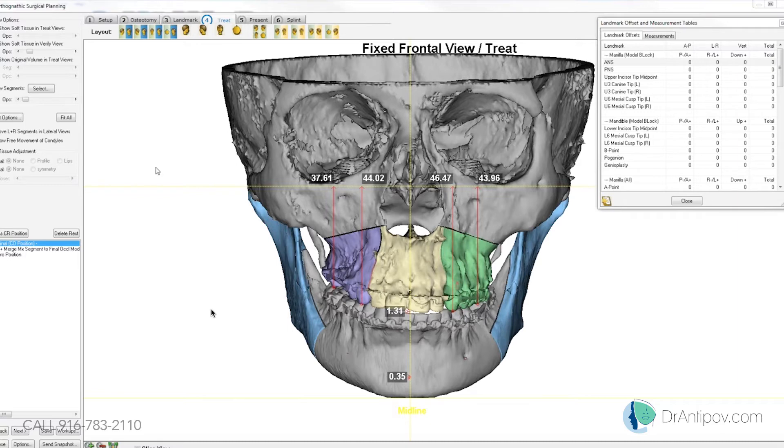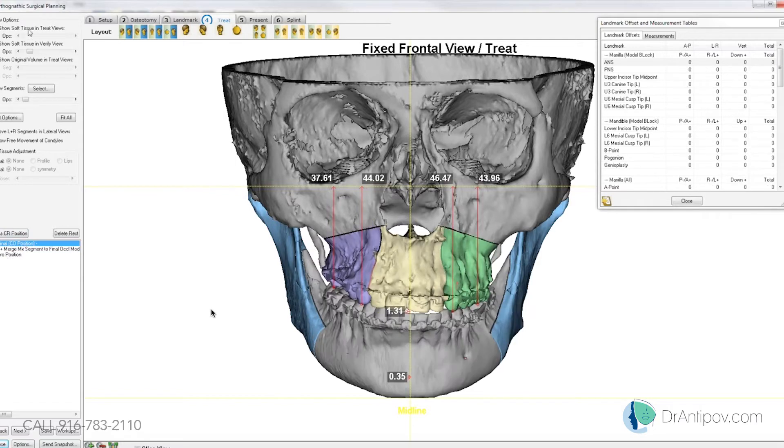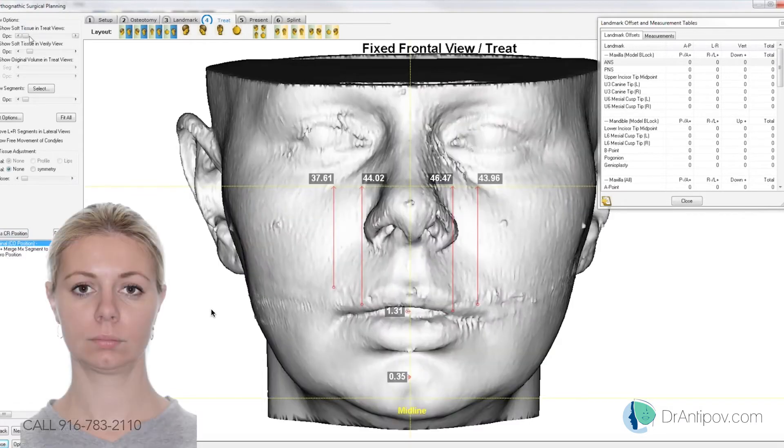I think we're set up pretty good here, so I'll go ahead and come in to the final occlusion. Let's verify the head position with the markers. I did some facial markers with the laser pointer — I just want to make sure they're on. In that frontal view, they leveled that yellow line. If we can just drop it down to that.